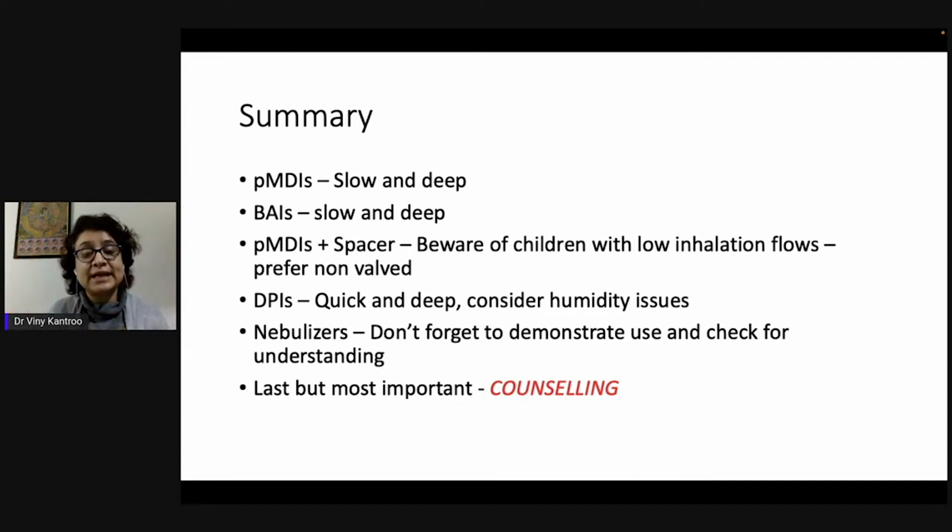which means that I inhaled slowly and deeply in case of a spray inhaler and remained there for 10 seconds, counting inside of my mind, 10 seconds, and then exhaling through my nose. On the other hand, if we consider dry powder inhalers, this action has to be faster and deeper.